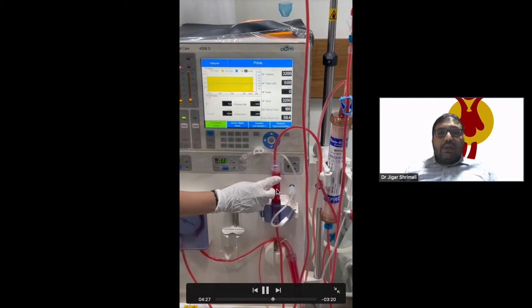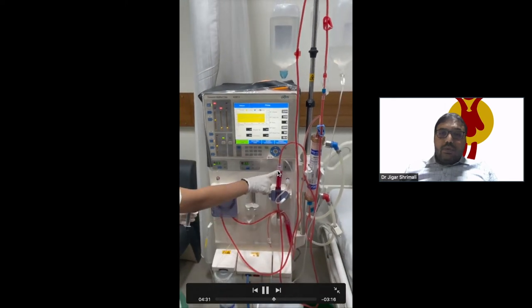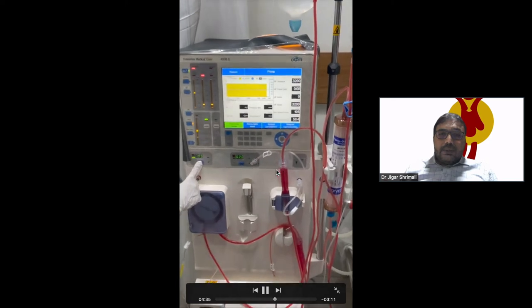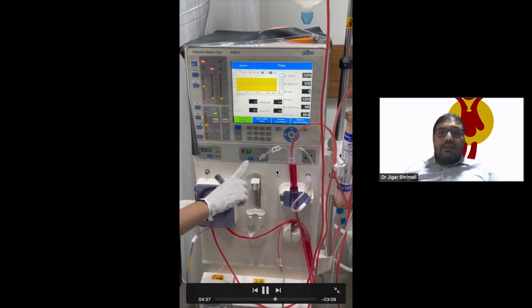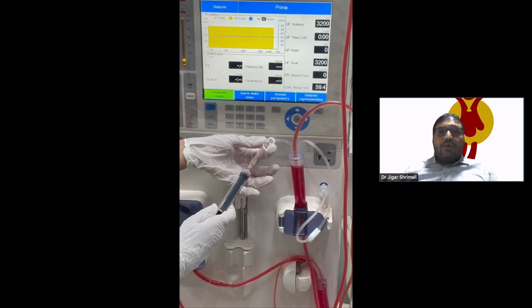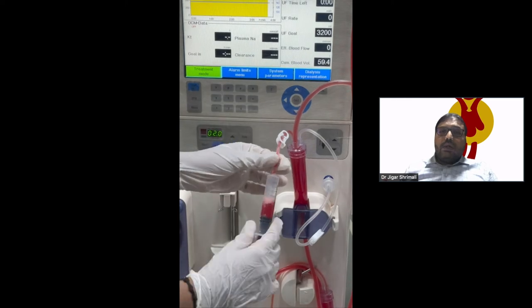We keep the pump running until the air is cleared. The chambers are designed to accommodate the air. Now we will close the air from the end and discard it. These chambers are made such that air will be accommodated and then removed.